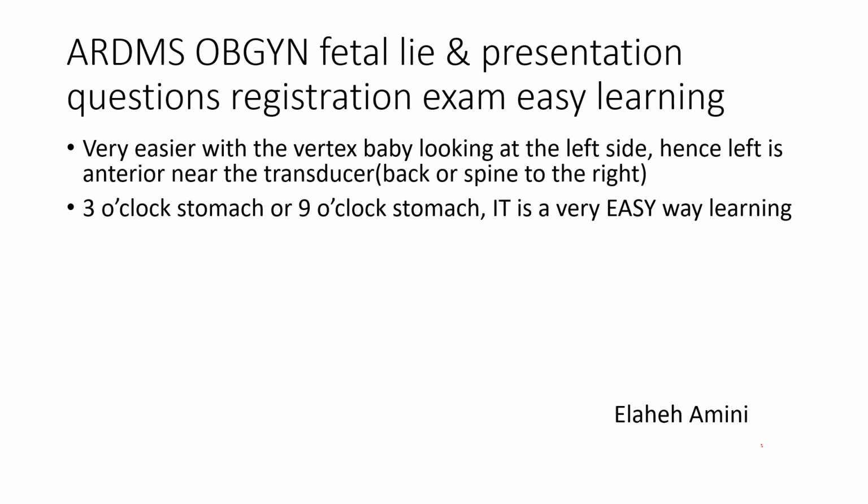Here is answering ARDMS OB/GYN questions, the easiest learning for fetal lie and presentation. The easiest way is first, in sagittal, determine fetal head and spine.